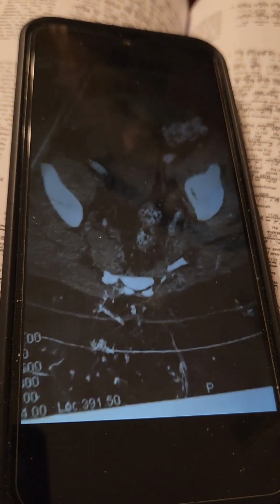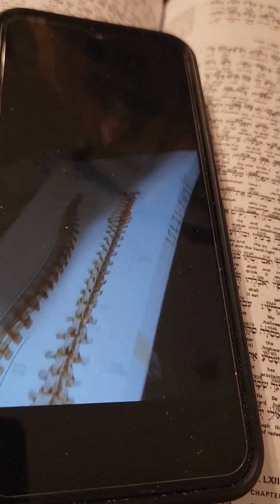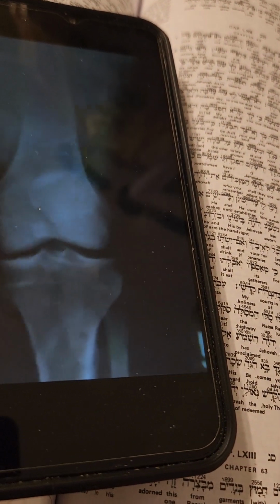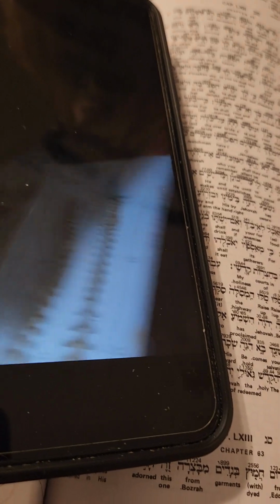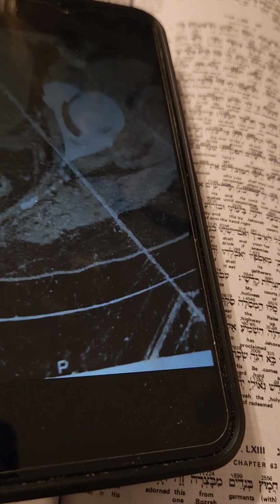And this is further down on the CT scan. Now, this is where it was healing, right? See how it's back in alignment? This is further down, right? But right away, you can see a difference between the bones on each side, right?